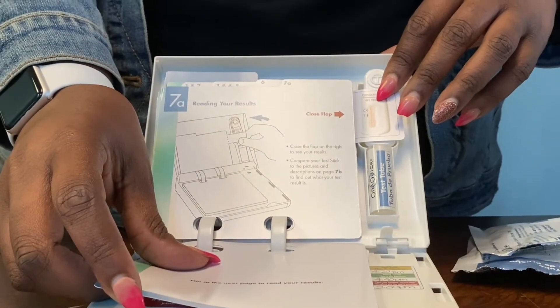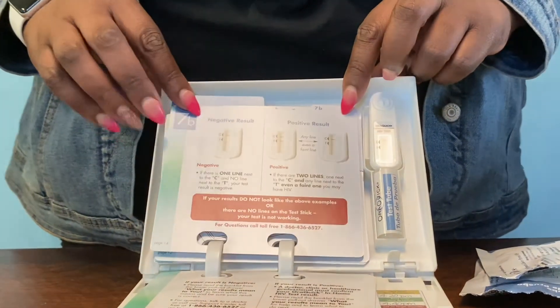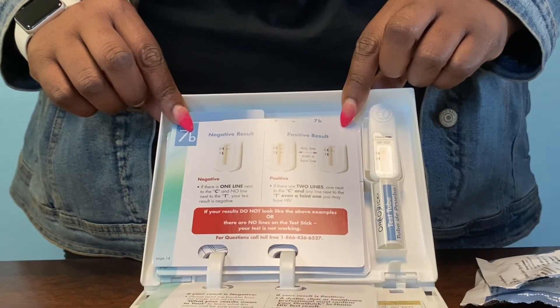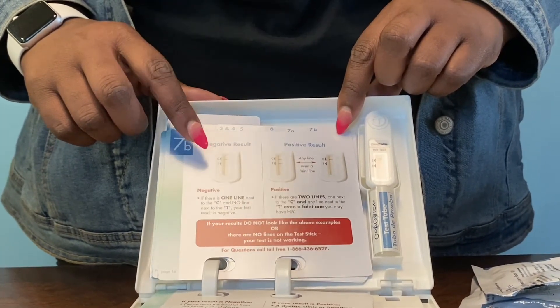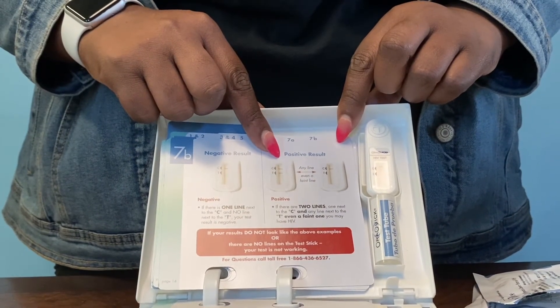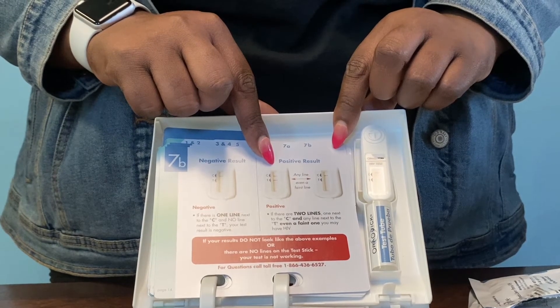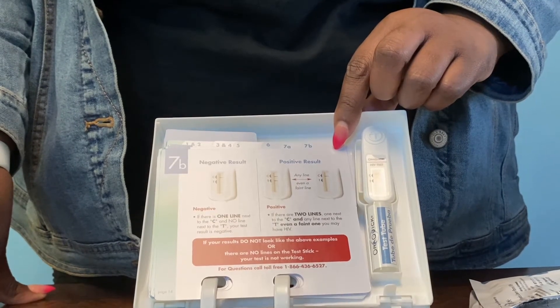After 20 minutes, close the flap to see your results. Compare your test stick to the pictures and descriptions on page 7b to find out what your test result is. If there is one line next to the C and no line next to the T, your test result is negative. If there are two lines — one next to the C and any line next to the T, even a faint line — you may have HIV. If your results don't look like either of these examples, or if there are no lines on the test stick, it means your test is not working.